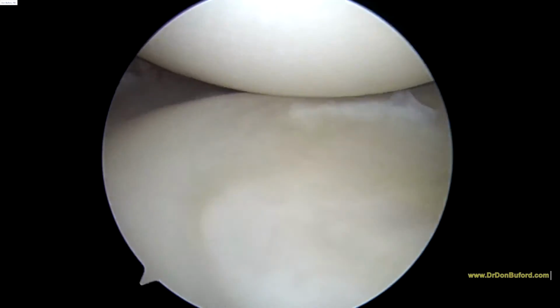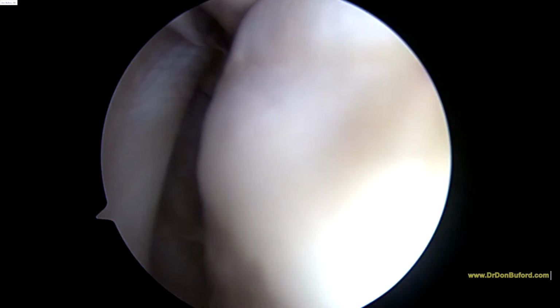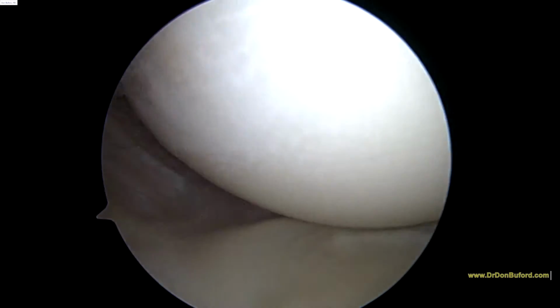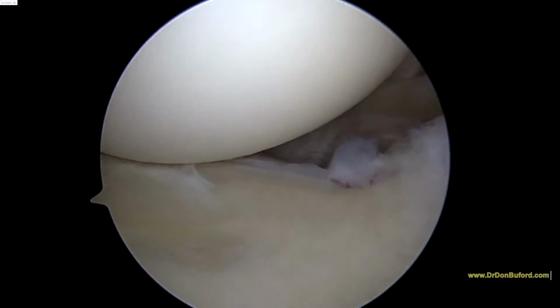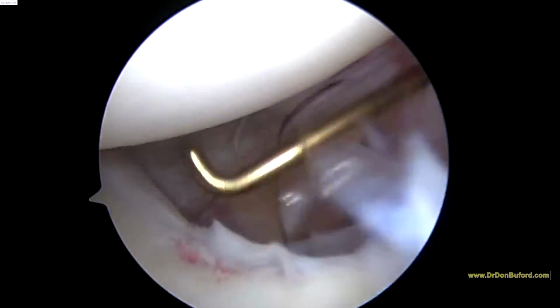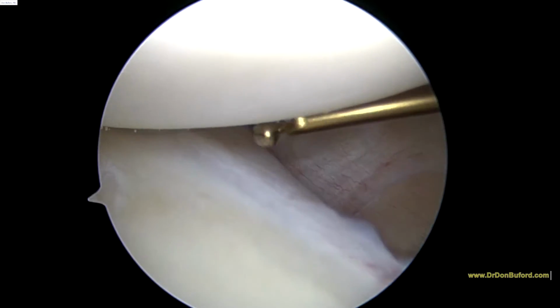Here's the posterior glenoid, posterior joint capsule. That all looks good. There's a little bit of thinning on the humeral head, thinning of the cartilage, but no significant lesions. And then as you come back around and look down the front of the shoulder, the anterior labrum here looks fine.